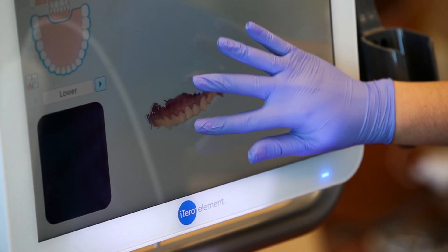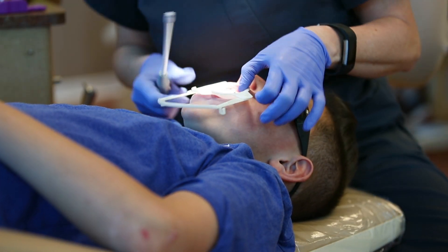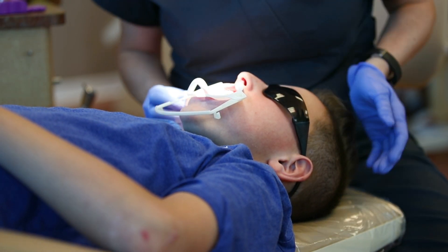The teeth need to be dry to place the bite blocks. These are lip retractors and they help keep the teeth dry by holding the cheeks and lips away from the teeth.